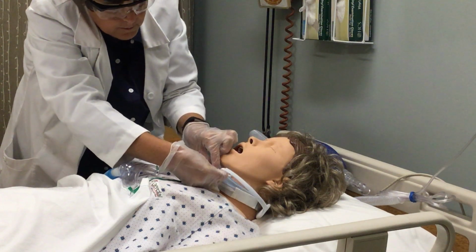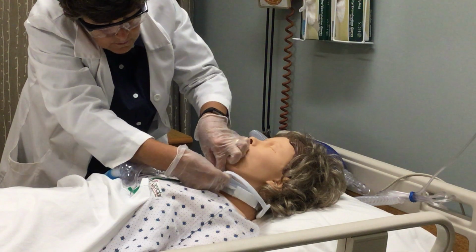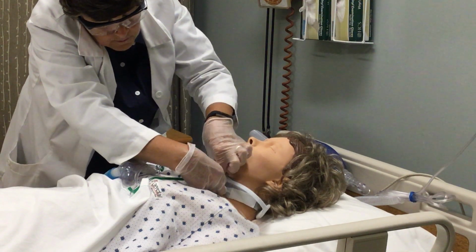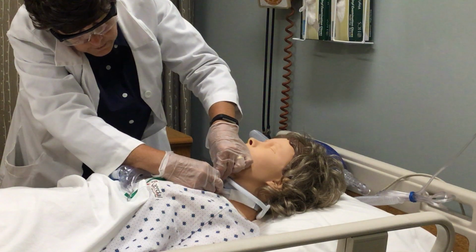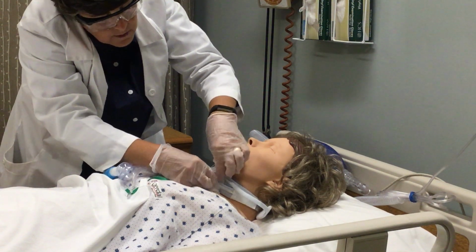And this is always a little bit of a challenge. It's a lot easier if you can get someone to help you so they can hold the plate in place for you. But I don't ever have that luxury.